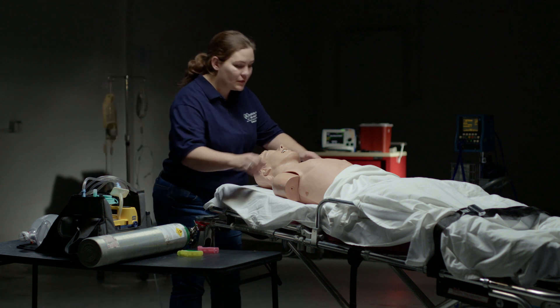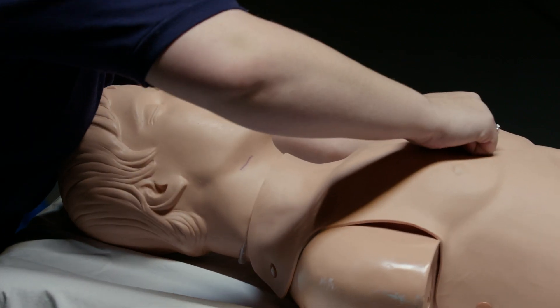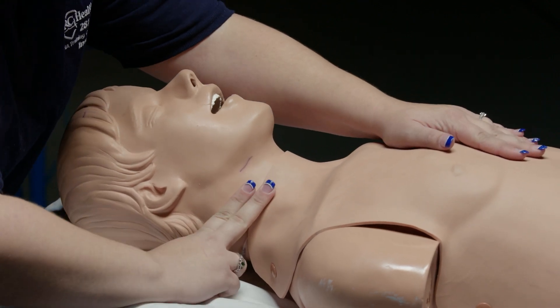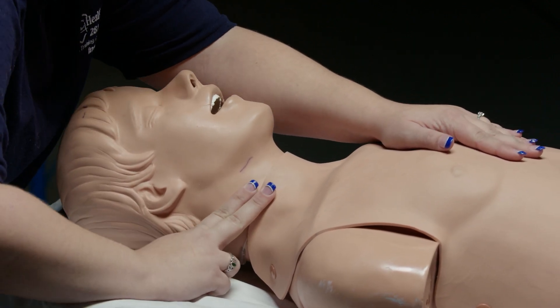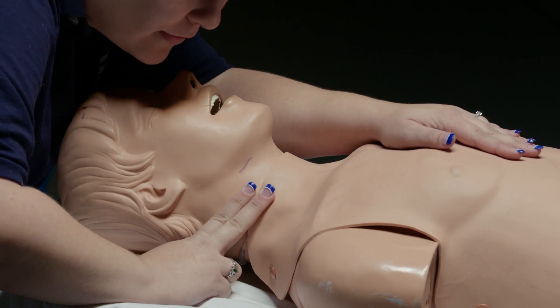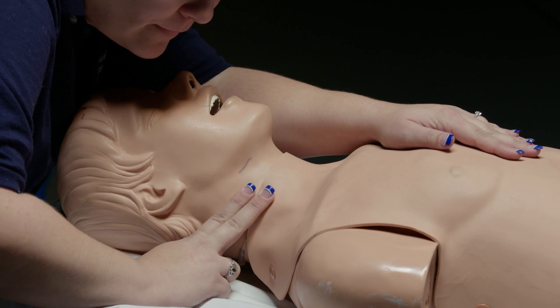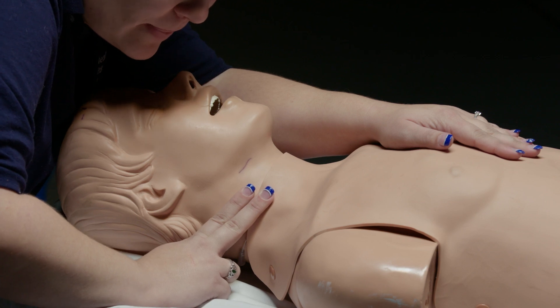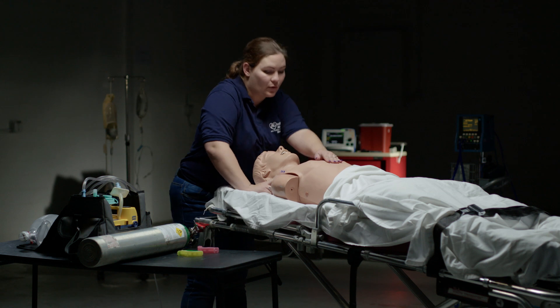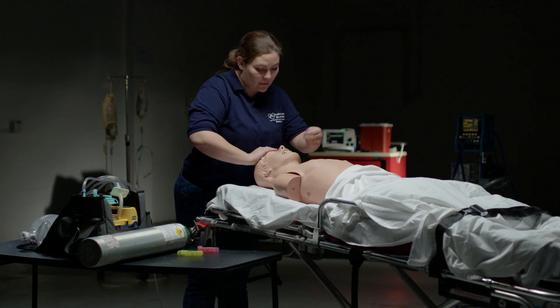BSI, scene is safe. Sir, can you hear me? I'm going to check for pulse and breathing at the same time for at least five but no more than 10 seconds. Patient is unresponsive, apneic, and has a weak pulse of 60. I'm going to go ahead and call for ALS.